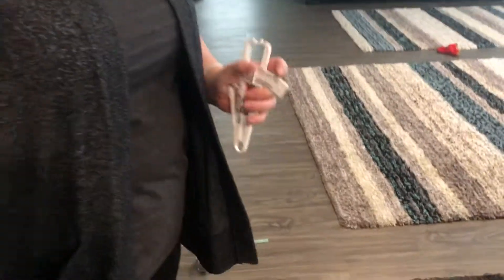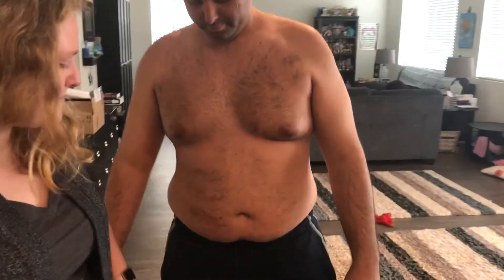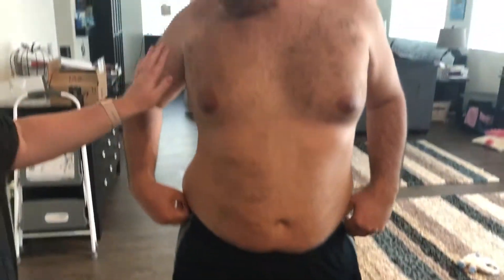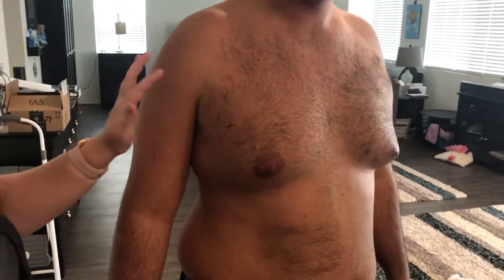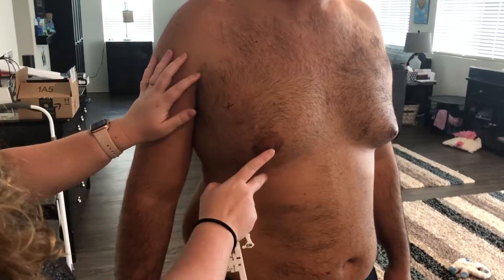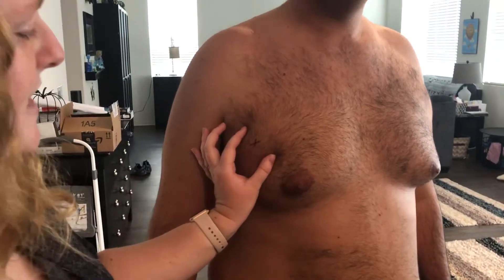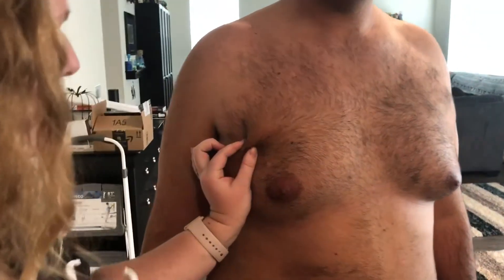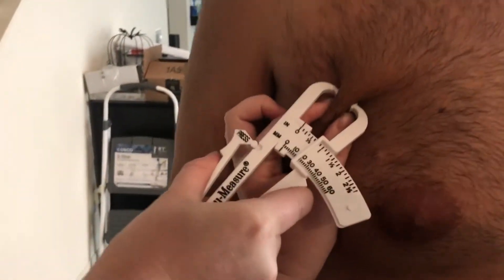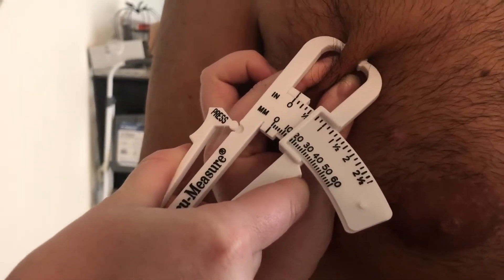We are gonna go ahead and do the skin caliper skinfold for body fat test. We're gonna measure the chest, abdomen, and thigh. I already pre-marked where we're going to be doing the measurements. You want to measure between the armpit fold and the nipple line — right here in between those two. Then you're gonna do a three-inch pinch and pull.